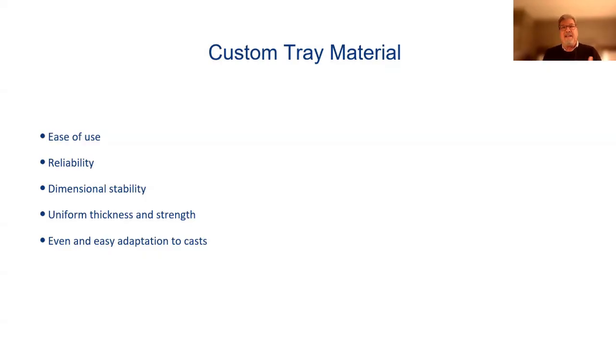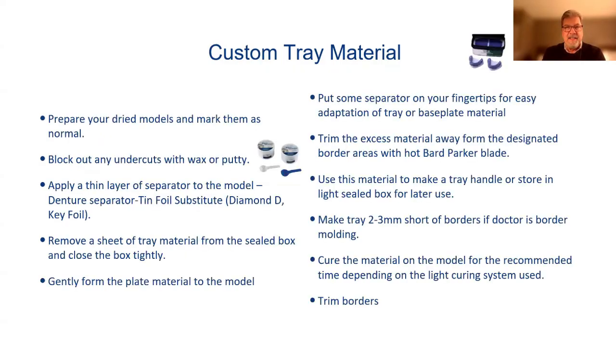Years ago, we had shellac-based plates we used to heat up with a torch and adapt to the model. And when we put it in the patient's mouth, what happened? It got kind of warped. Then we would also make base plates out of acrylic. But now we have the light cure tray technology that really works well. And I like the Stern-Tech material. It's a great custom tray material, and I've used it for many years.